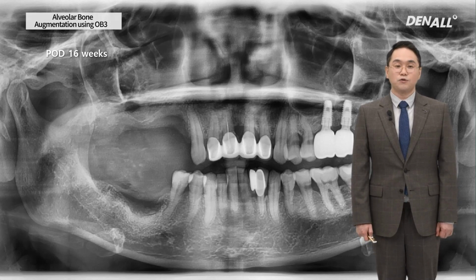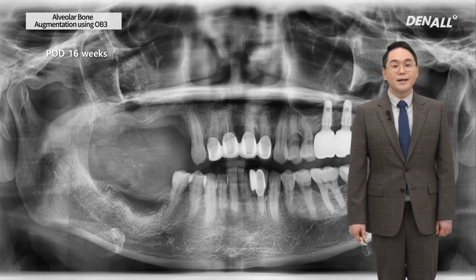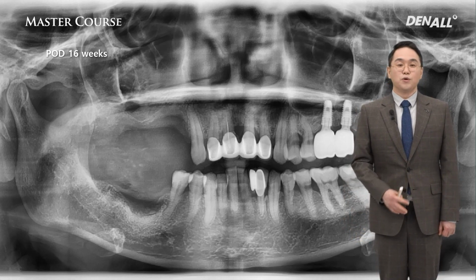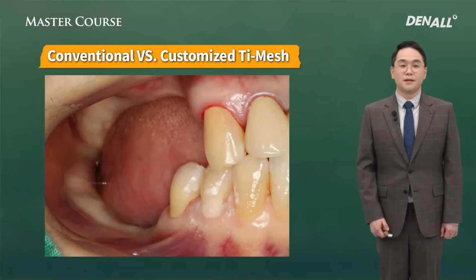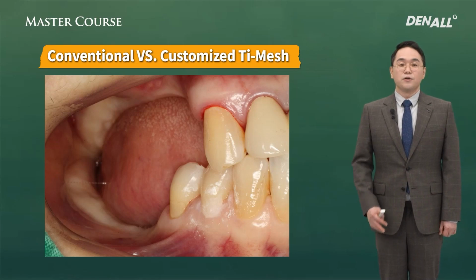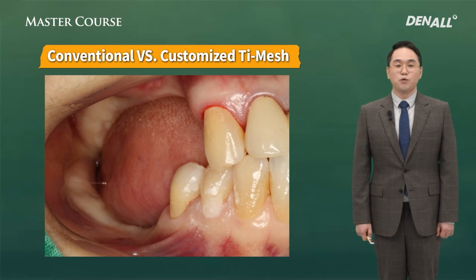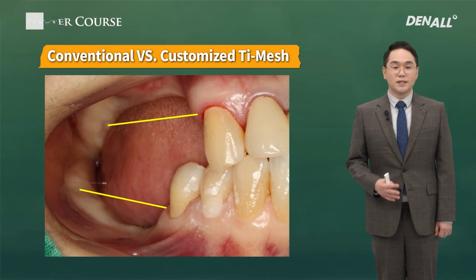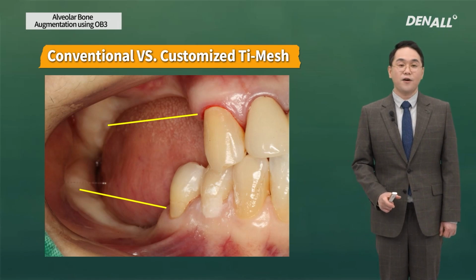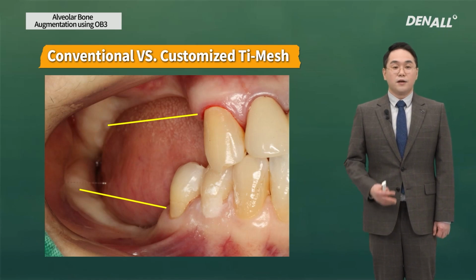Now, the right implants need to be placed according to the plan. On the panorama, the right side of the patient has vertical bone loss, but we cannot tell how much bone loss there is. If you look at here, there is vertical wide-ranging bone defect in both quadrant 1 and 4. We need to do ideal vertical bone augmentation to come up with ideal prosthesis. The vertical bone defect volume would be more than 3 millimeters.